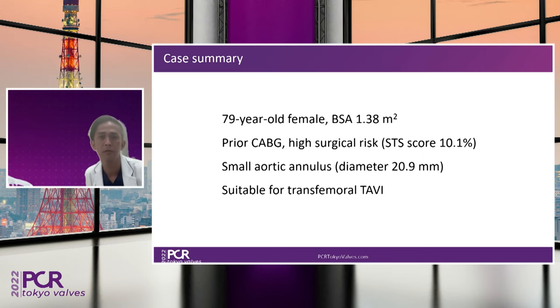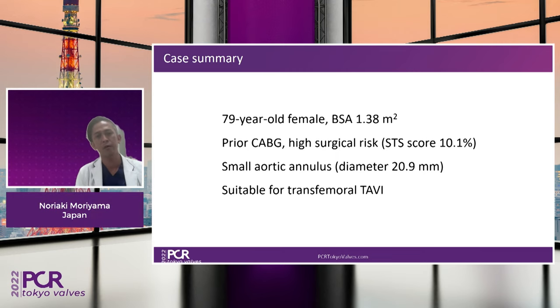Okay, slide please. So I just briefly summarize. The patient is a 79 years old female with a small body. Obviously, the patient has a very high surgical risk. So we selected a transfemoral TAVI. Next slide, please.